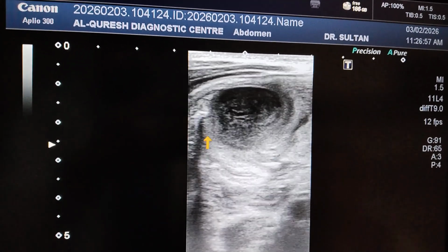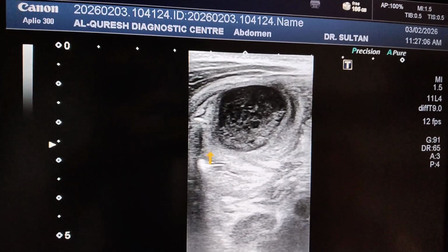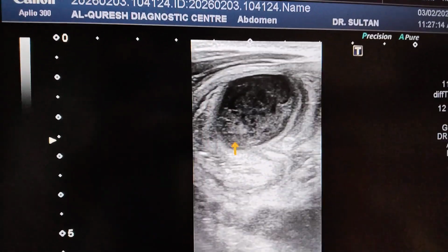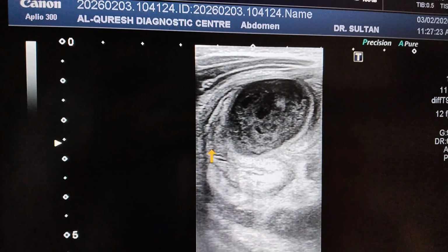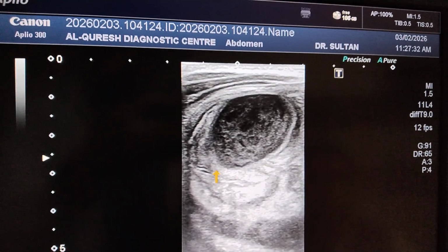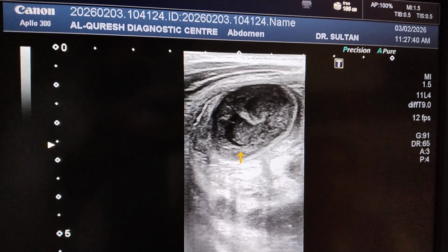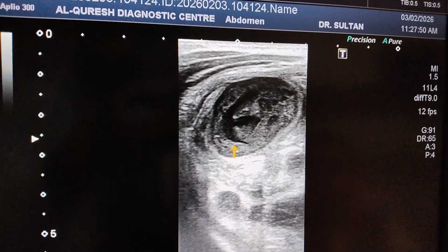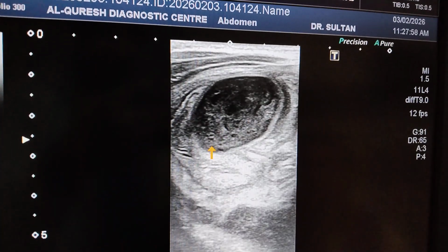This is the gangrenous appendix, and this is the edematous gut loop, distal ileum, surrounding it. And one such picture is present. This also appears as a mass. So further we can say it is an appendicular mass. So this was all about the disease process of the appendix, starting from acute appendicitis to the gangrenous appendix to the intussusception and to the appendicular mass. Thank you very much.